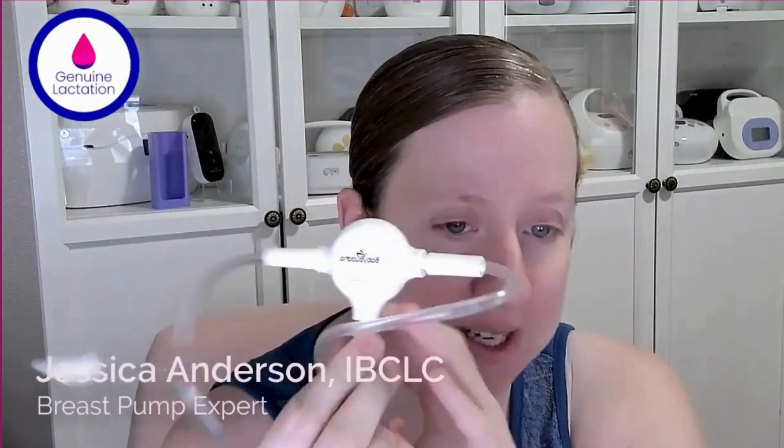So the first thing is: what on earth is this little piece? This is called a T connector. On the back here, you'll see that there is a three-way switch. If it is all the way to one side, it is pumping single sided. If it's in the middle, you get suction in the center — it's double pumping. If you push it to the other side, you're single pumping on the other side. These adapters plug directly into the back of your Baby Buddha flanges, just like this.